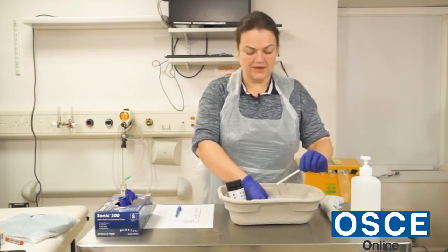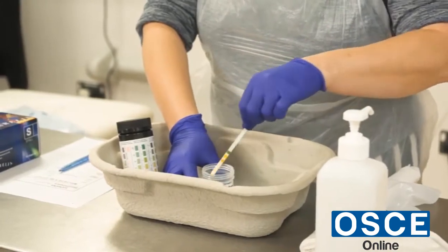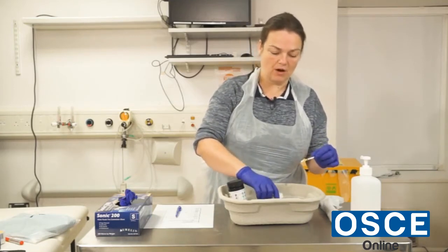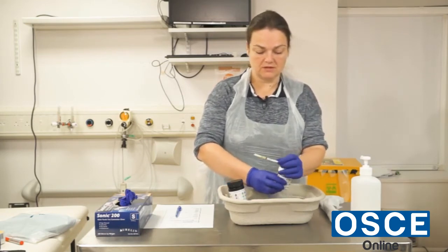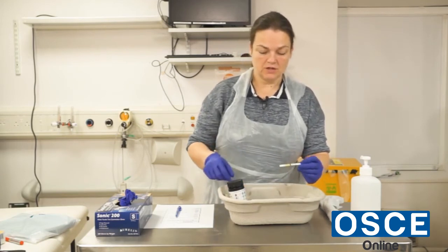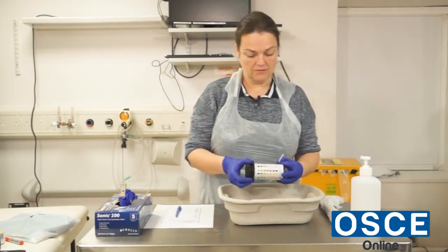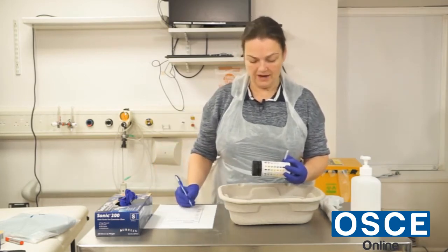So I need to dip this for no longer than a second. And then I'm meant to just scrape the excess urine off on the edge of the pot and just put the lid back on. Obviously, that's quite important to put the lid back on. Put that out of the way for now. So after 30 seconds, I am going to read from the pot what the results are. So the first one's glucose, and that's 30 seconds gone, and that is actually negative.